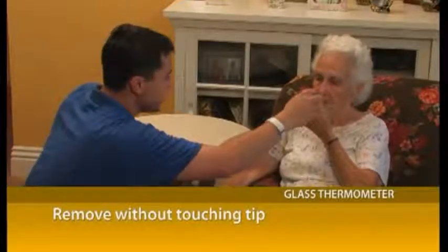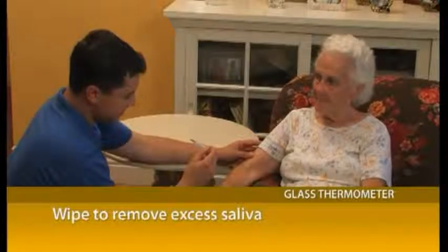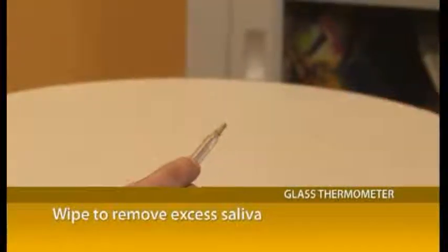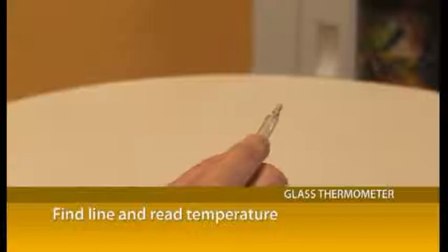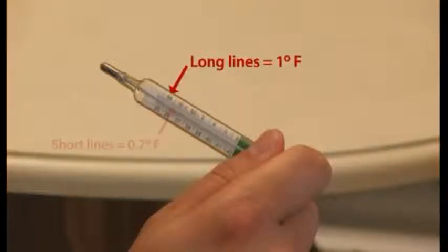Remove the thermometer without touching the tip. Gently wipe the thermometer with a tissue. Slowly turn the thermometer until you see the colored line. Each long mark on the thermometer is the same as 1 degree. Short marks are the same as 2/10 of a degree.